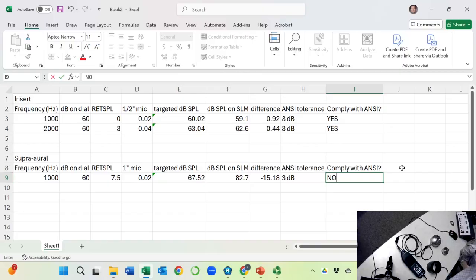Imagine when we do bone conduction, we put it on the mastoid. It goes through the temporal bone. Am I making sense? So we need something that mimics the response of the human temporal bone. Does that make sense? And so, can I borrow your temporal bone for a few minutes? No, I'm kidding. I'm kidding you. There's no way we can do it.